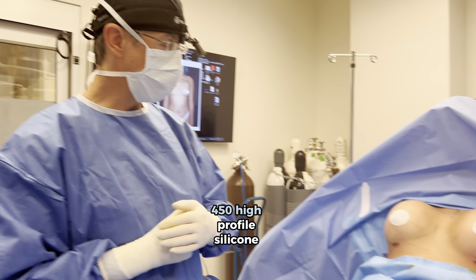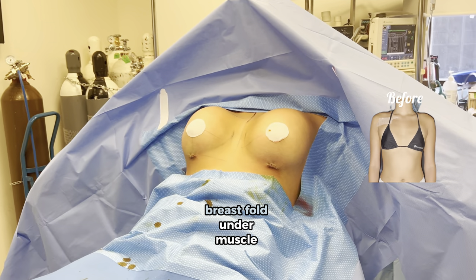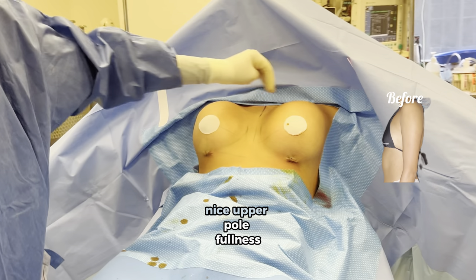And we are done — 450 high profile silicone breast augmentation, breast fold, under muscle, power boost, nice upper fullness.